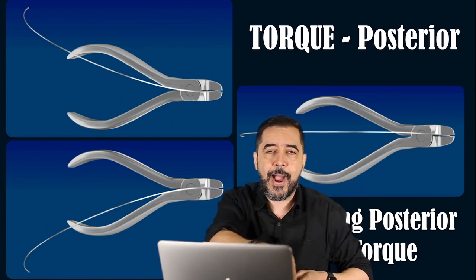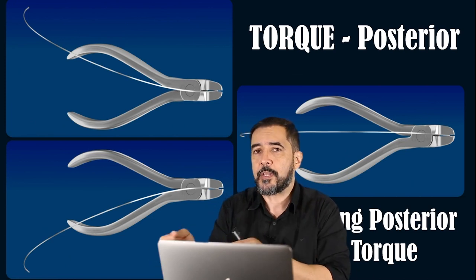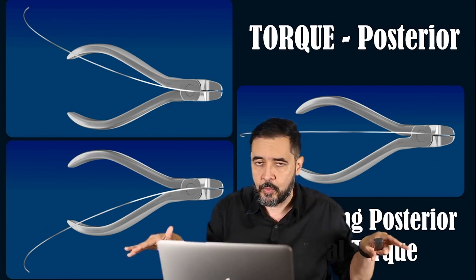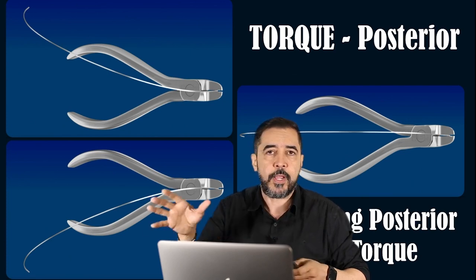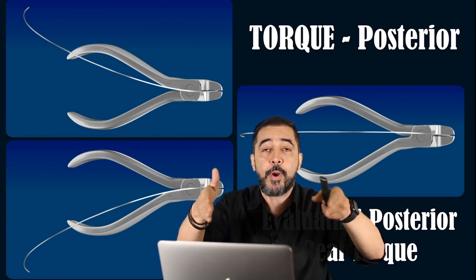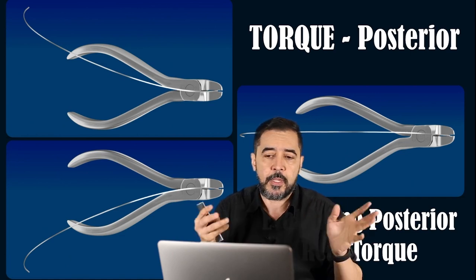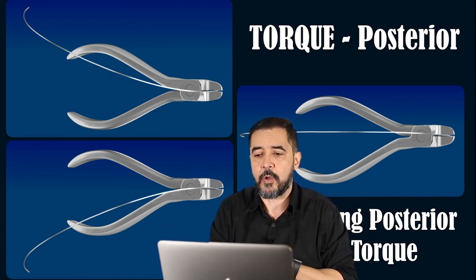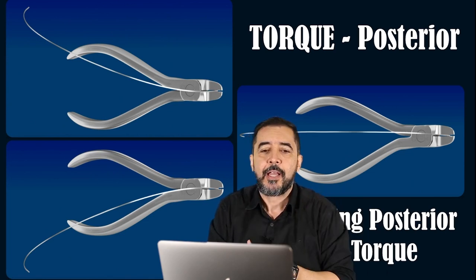It's like we buy it from a company and we put it in our stock. So this is how it comes for us. It comes neutral, unless you buy a different brand of arch wire that already comes with torsion. It's not common. It's not something that I'm used to seeing in my country at least. Okay, so in this situation we have no torsion.